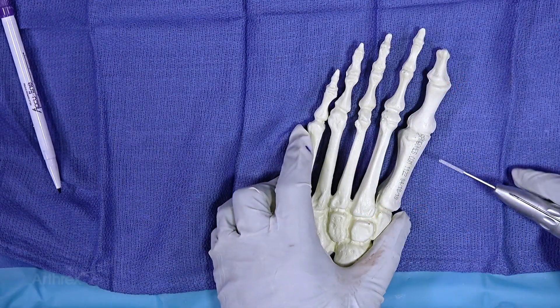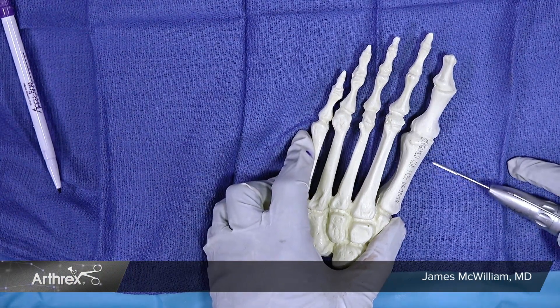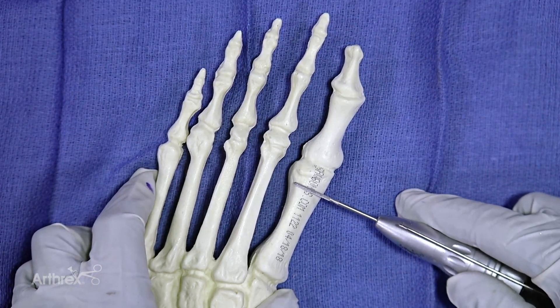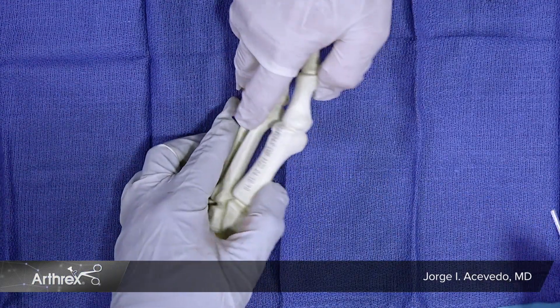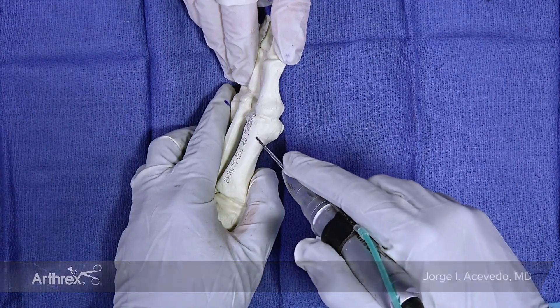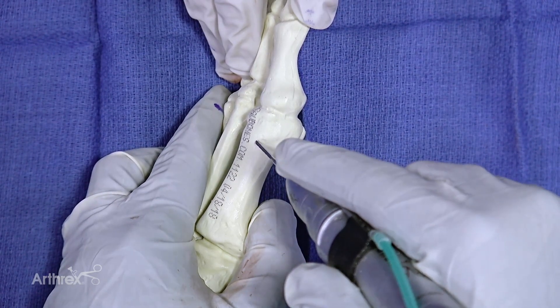This is a sawbones that does not have a bunion deformity, but it's fine for us to demonstrate the maneuver with the burr for the chevron. We're using a 2 by 20 millimeter burr that's going to remove two millimeters of bone, so we're already shortening the metatarsal. It's important to note that the starting point for the burr is at the junction of the top third and inferior two-thirds of the metatarsal.